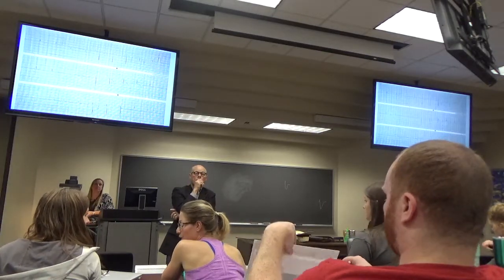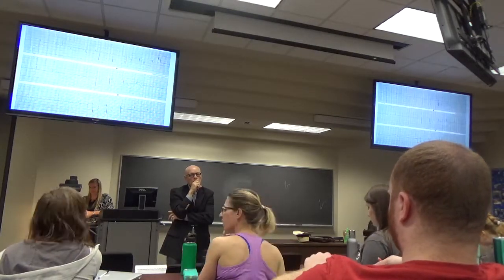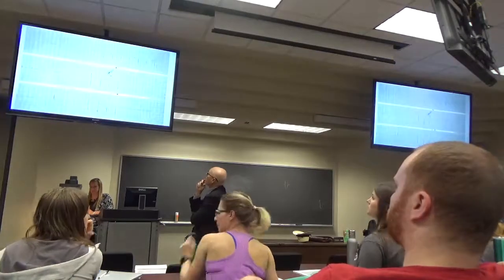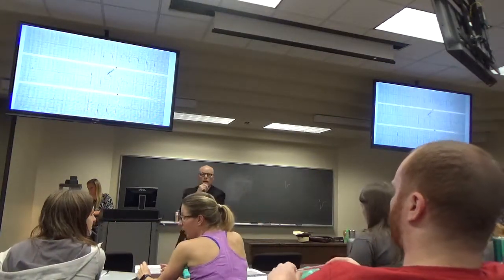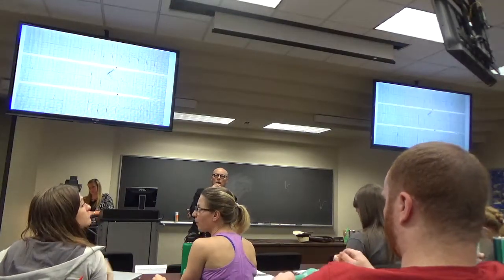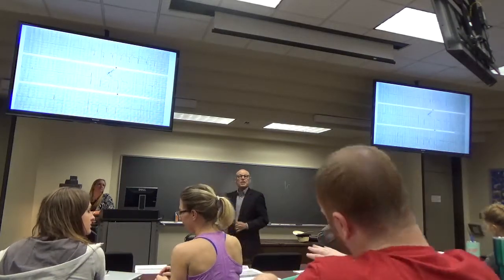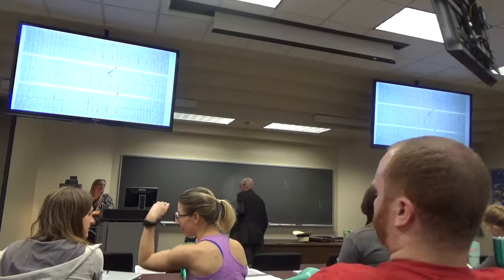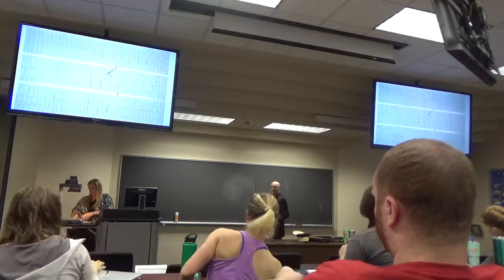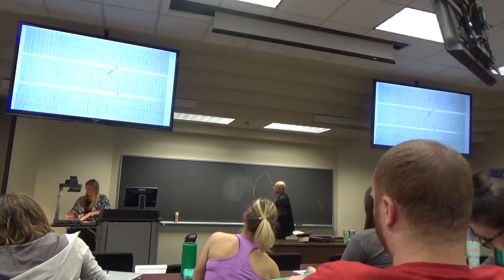So you said on the aneurysm pattern, if you see ST elevation and an upright T wave, then it's more indicative of an aneurysm. Also, she wrote concave on the EKG. Is there any other sign for aneurysm as compared to ischemia on an EKG? No. On an EKG, the only sign of an aneurysm is that first of all you have to have a Q wave. Then the ST segment is elevated and the T wave is upright.